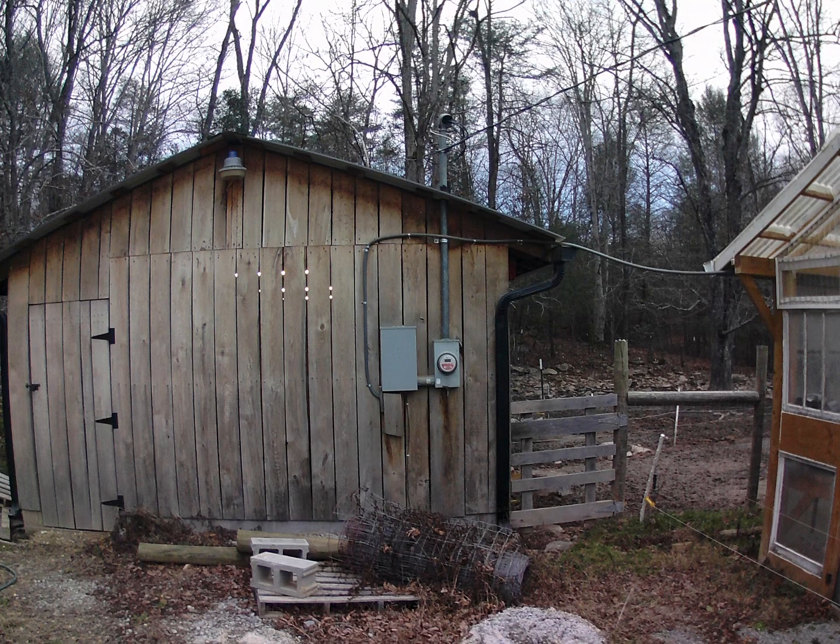Alright guys, on this cold morning we are with Josh at Holly Brook Farms and we are artificially inseminating pigs. I just thought this would be a good video for everyone to watch — hope you enjoy.